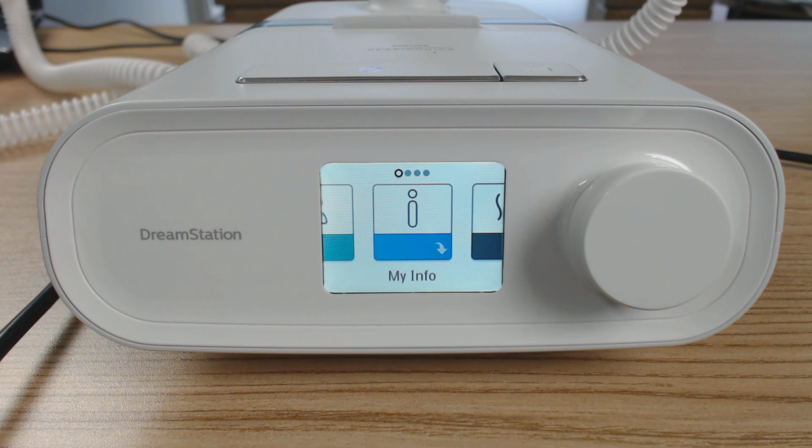Welcome to part 2 of our 3-part series on the Philips Dreamstation. In part 1, I went through just setting up the machine. In part 2, I'm going to go through the menu, and then in part 3 we're going to go through the clinical menu, which is a bit more advanced, if you can be bothered getting that far into the series. But let's have a look at the menu system.